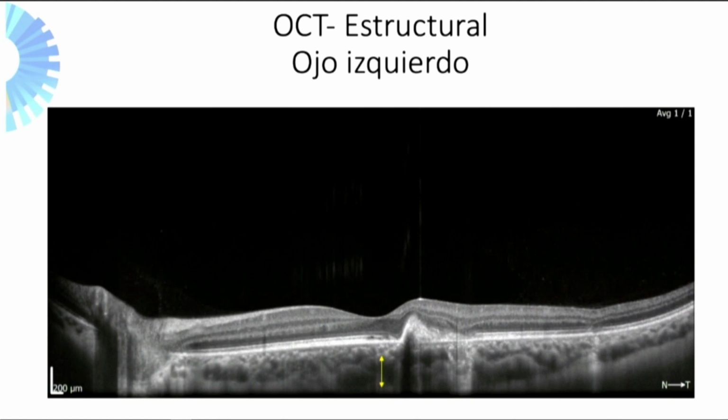On the left eye, we get to see the issue, and it is important not to only ask for angio-OCT. Tonio mentioned this, and I say it again: we have to correlate mode B with angio-OCT. When we see defects on the external retinal layers, we see below them increased thickness of the choroidal layer.